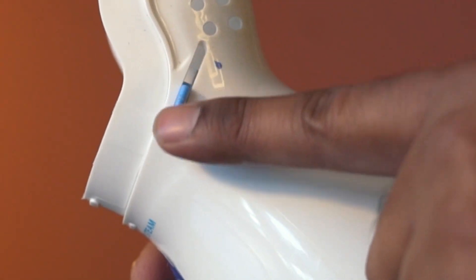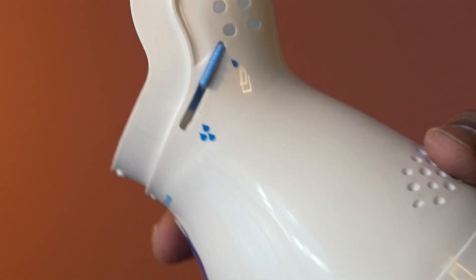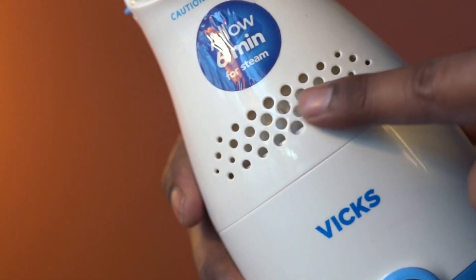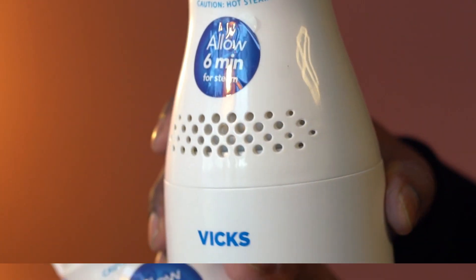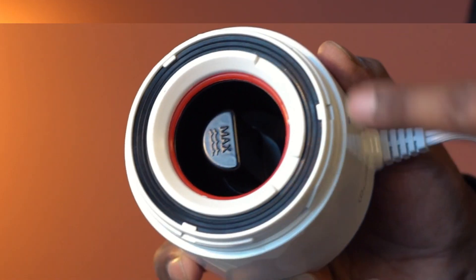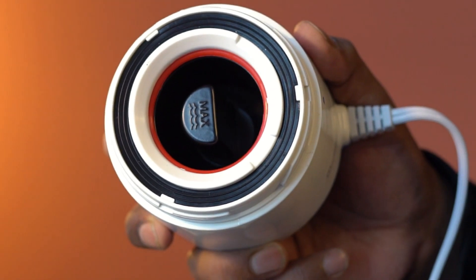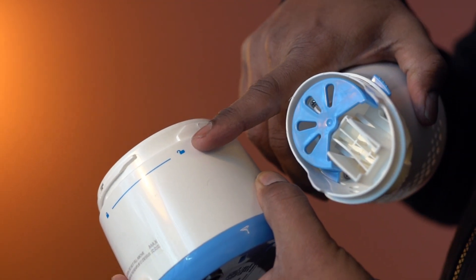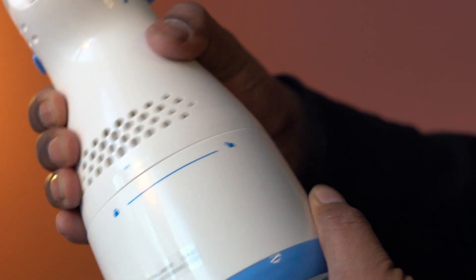You can adjust the steam intensity using this knob. And here are the vents. Here is the heating element, and this is where you would add water. Opening and closing the top housing is easy — simply follow the signs here.